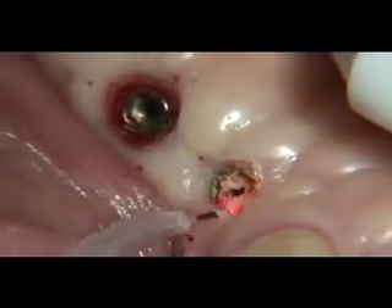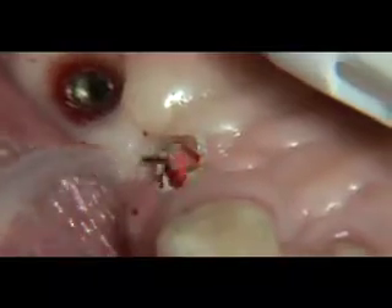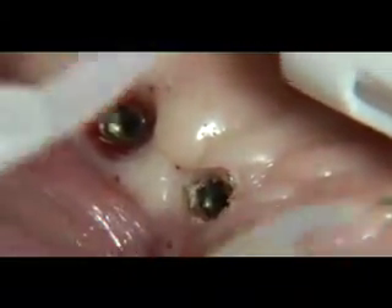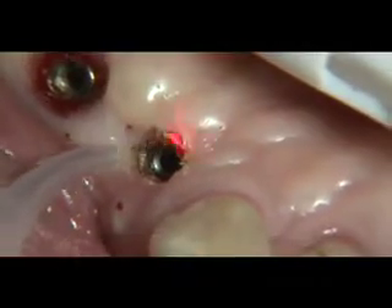A scalpel can be used to acquire access to the implant, but this surgical procedure is often accompanied by significant bleeding, leading to poor visibility and can create unnecessary trauma.